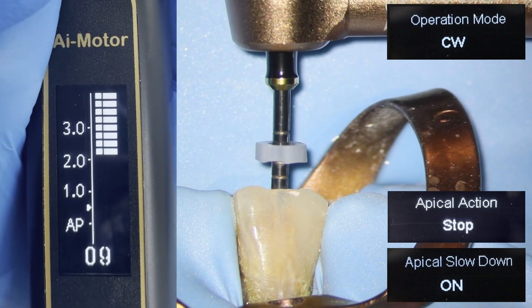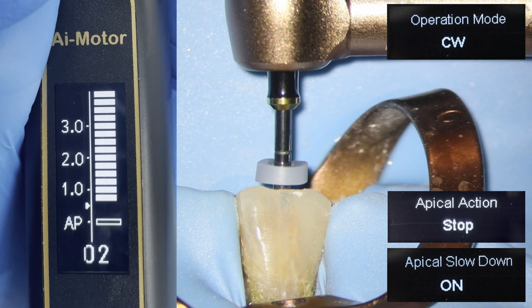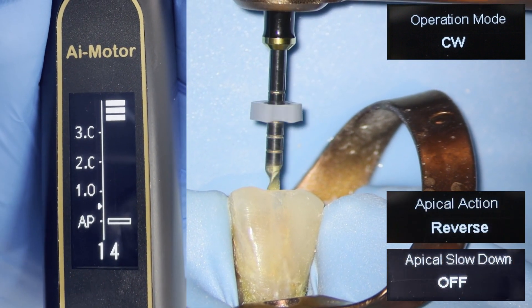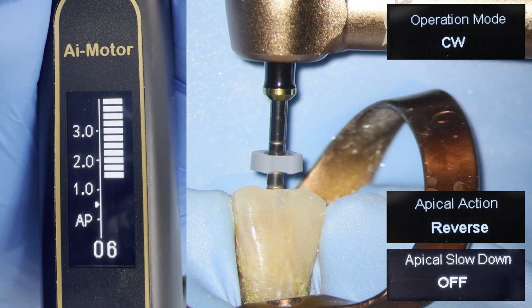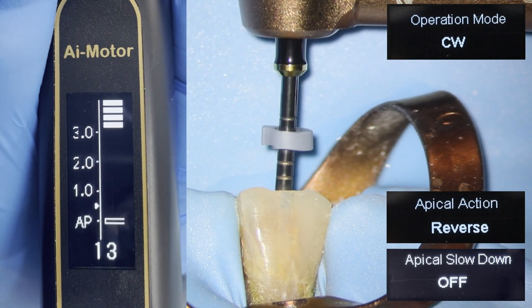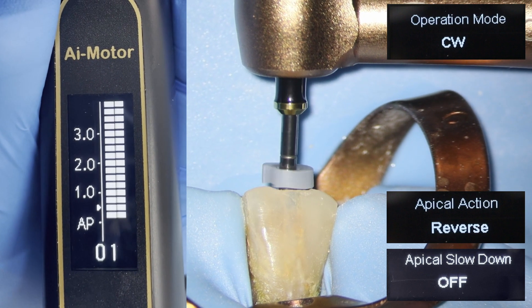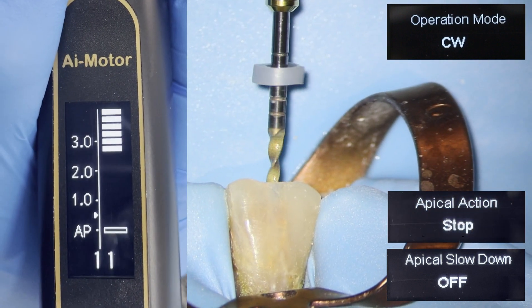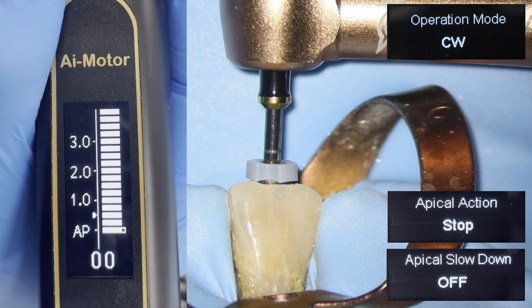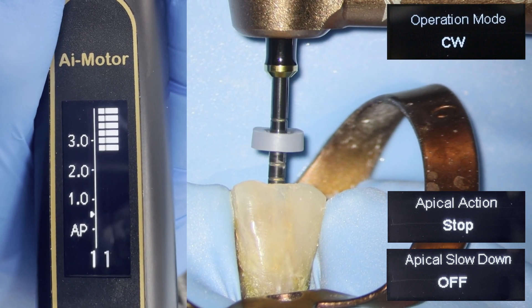You need to be careful in stop mode because sometimes when it stops abruptly, it can jam itself into the canal. With apical slowdown off and apical action set to reverse, the file will not slow down as it reaches the apex, and when it does, it will quickly reverse — blink and you'll miss it. With apical slowdown off and apical action set to stop, it won't slow down and will abruptly stop.